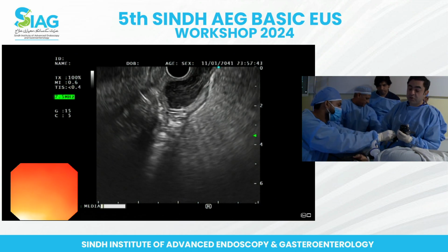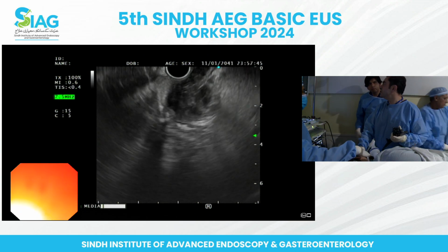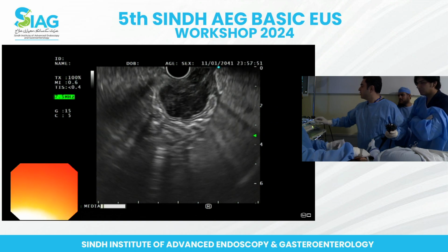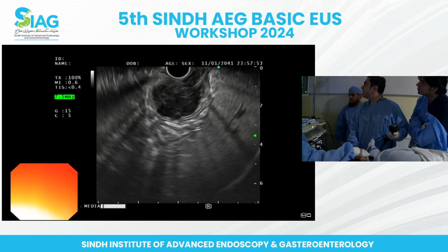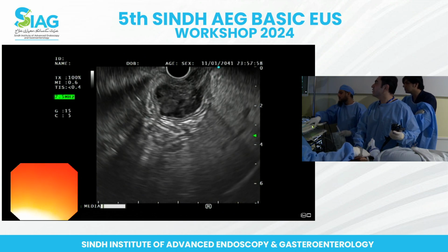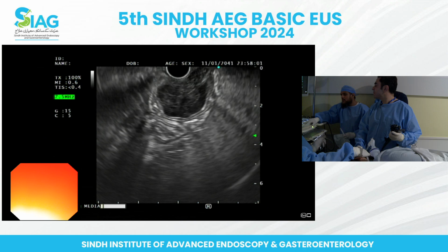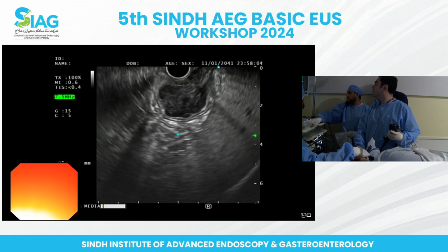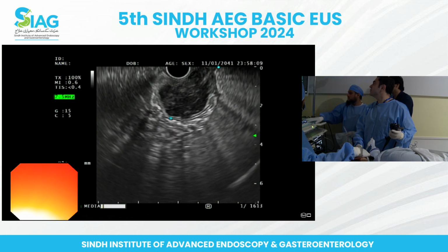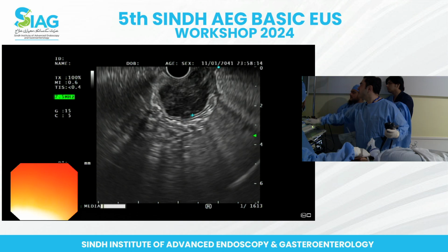So from my side, it looks epithelial or superficial. It doesn't look deep. And then duplication cyst, you want to put a section on just to make sure you don't have to go back in there and not get it. Okay, so I'll just measure it if I can. Can you just measure it, please? Covered by all 4 layers. Can you pause it and then measure it? Please, and then measure it. A submucosal tumor, only attached in one area. So it has to be measured. That can look like this too, like the layers are, except one area.